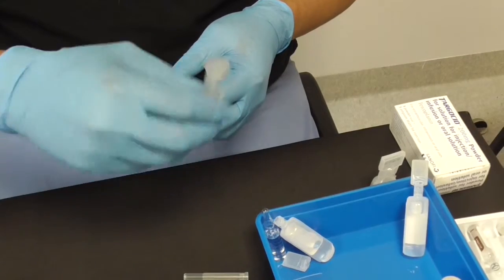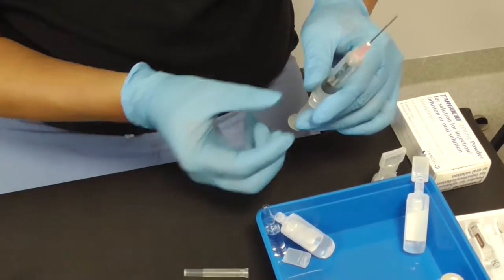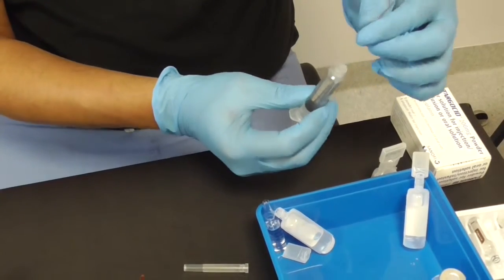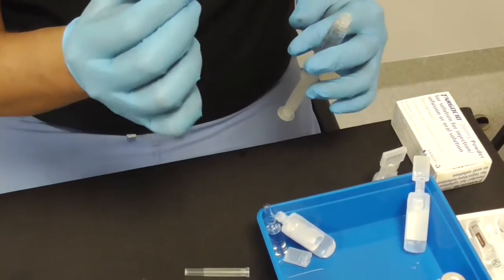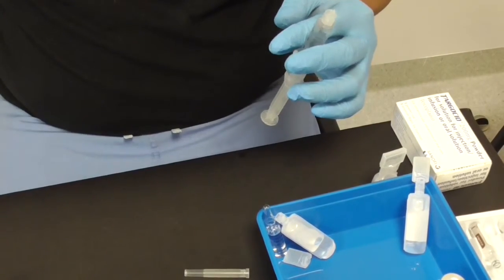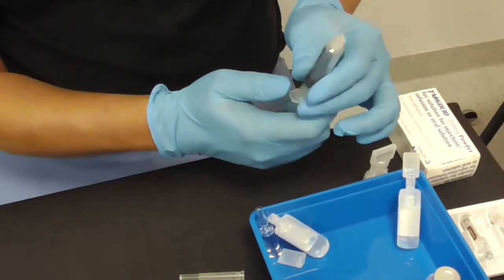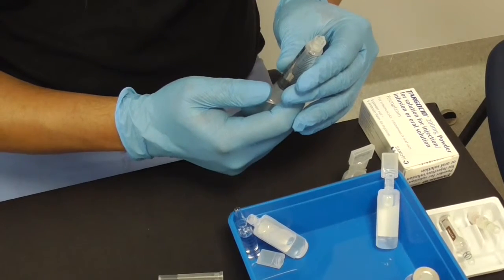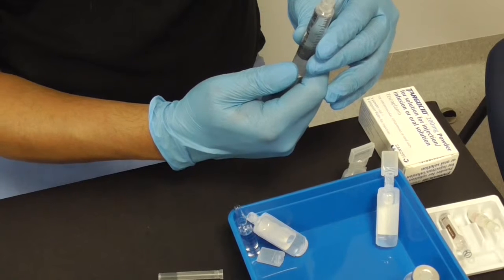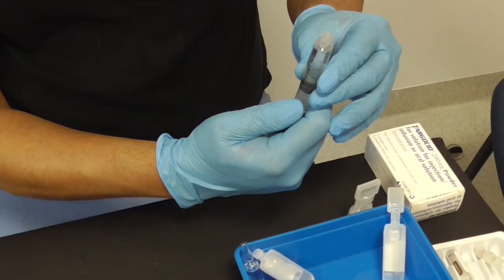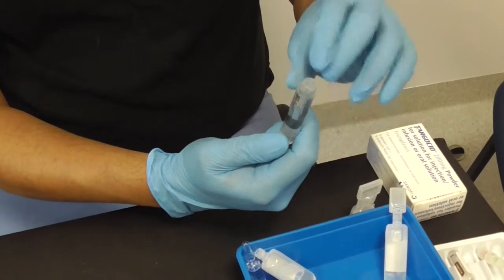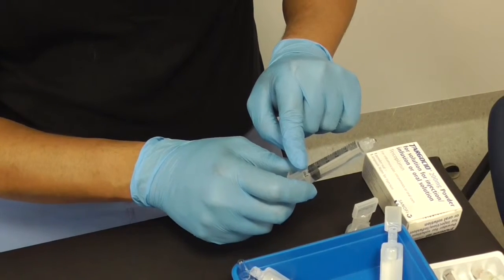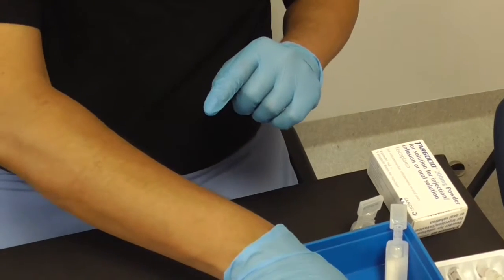A neat trick is to turn it upside down, give it a little swirl, and then you do that. And it just causes all the air bubbles to go into there. Now when you finish with the needle, you hold it, and it's a luer lock, so I've undone it. Take the needle and throw it into the sharps bin. You can hear that. And now you've got to make sure you don't put any of that air into the patient because then they'll get an air embolus that'll go into the brain or lungs and they can die. So you just gently push until that air bubble goes all the way out. There you go. You can see the little bubble of fluid, so you know that you've got all of it out. You monitor and see how much you're going to give.